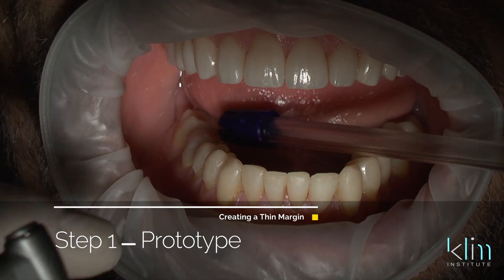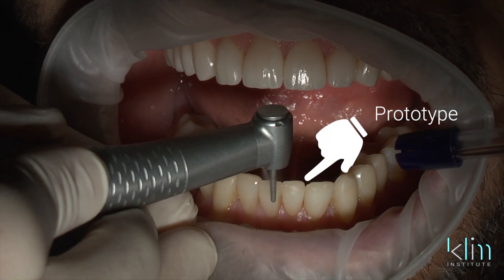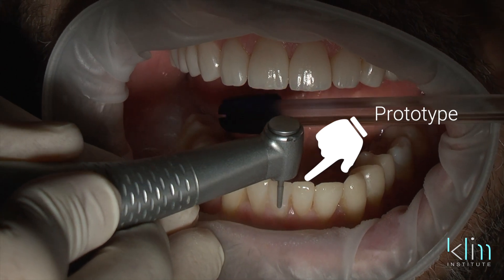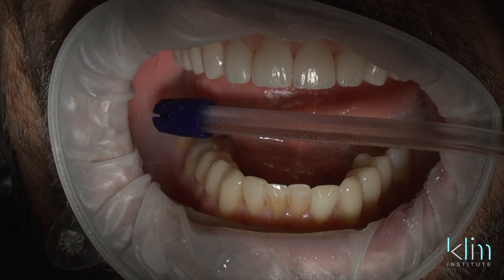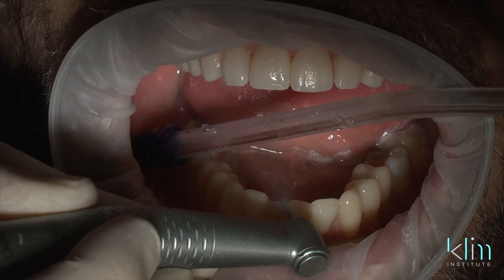Step one in creating a thin margin is during the preparation stage — you need to go in pre-planned, have a mock-up, have a prototype. We prep through that prototype when it's on the teeth. Often we don't have to reduce very much if we're doing an additive technique with our restorations. It's on enamel; you don't have to prep the tooth way back to create clearance for that ceramic.